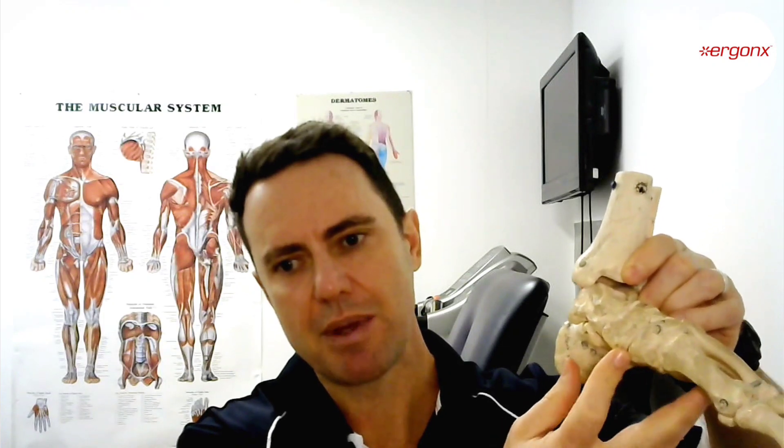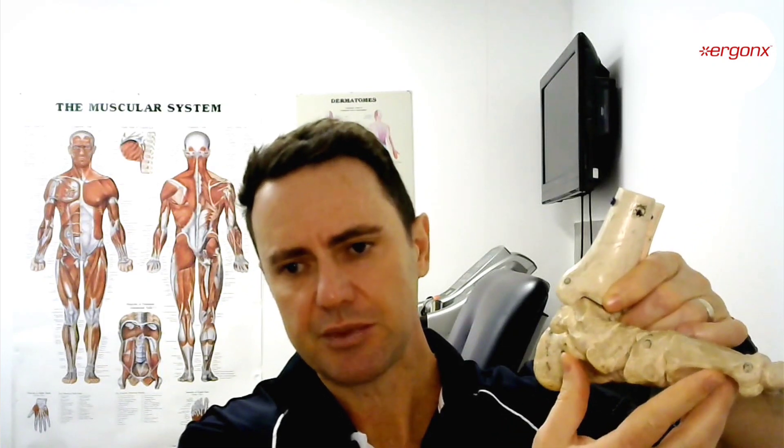What you can see immediately is that the gaps in the joints start to open up through here. As we overpronate, this gap opens up and the little supporting ligament that attaches between these two joints will actually get strained as we load it over and over again in walking.